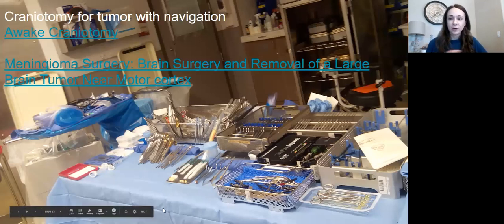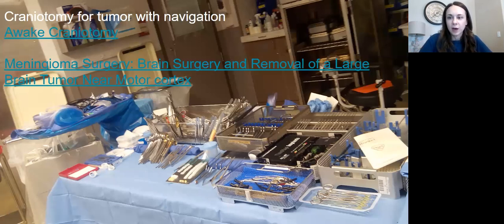Some procedures are going to be more like what's in your book, more invasive. So you're going to need 3-4 times that amount of suture. So pay attention to how big your bone flap is, and that will tell you how much suture you're going to need to close that incision.